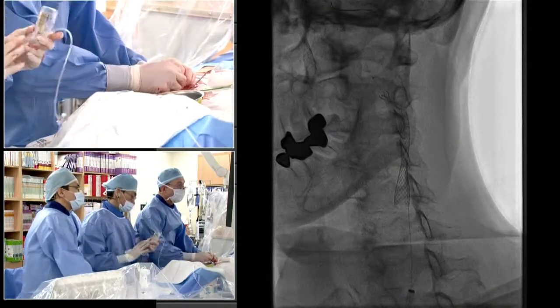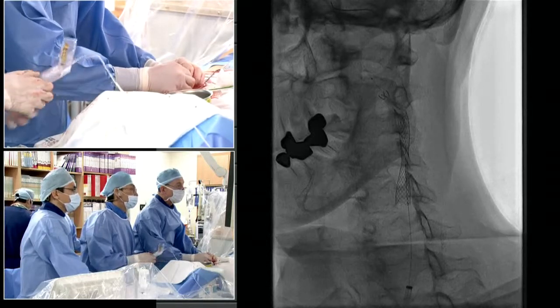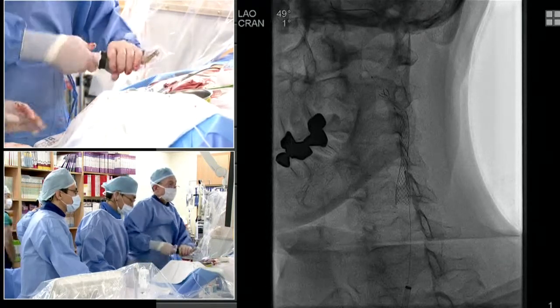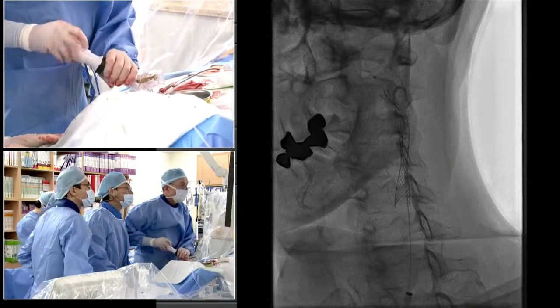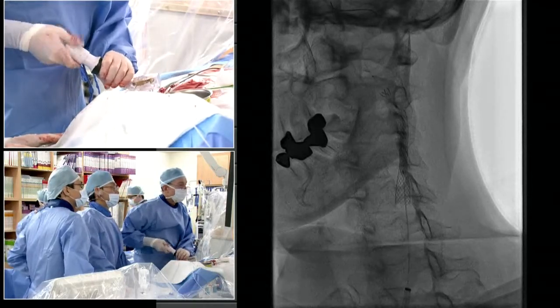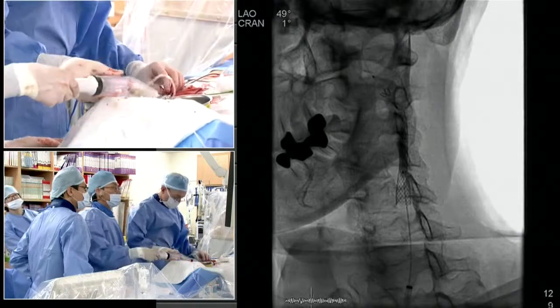Mark, it must be fun for you to do this case since you couldn't do this case today in the United States. That's right, unless the patient paid on their own. Yeah, exactly. Virtually everyone is a Medicare patient who is 74 years of age. And unless, occasionally we have these discussions in the office where the patient would say, well, what would you want done? And if I say stent, sometimes they'll bankroll a stent, but that's not very common. Usually our therapy has had to change, unfortunately.